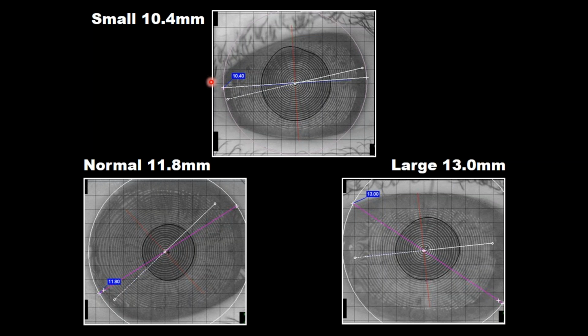Similarly, if we put a small diameter on a big cornea like a 13 millimeter and we come back the next day and find that the patient has a massive amount of decentration or central islands, that's most likely because we had the wrong diameter of lens for this particular cornea. So pay attention to VID. It's one of those things that can help you in achieving success, especially if things went a little bit sideways. It's usually one of the great indicators of what change we need to make to the lens.